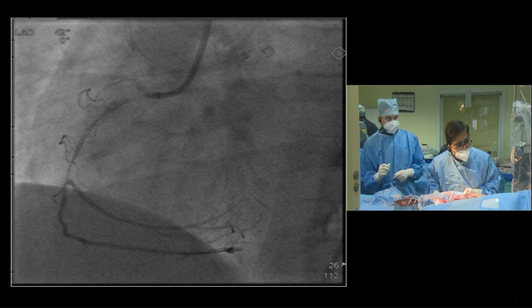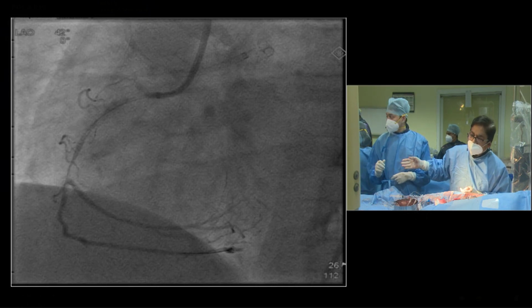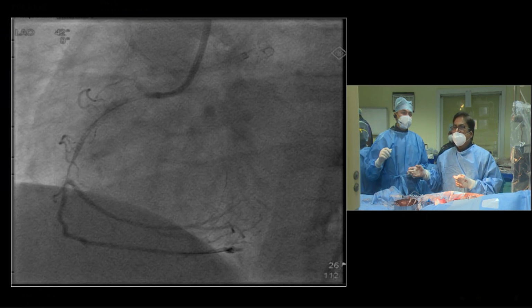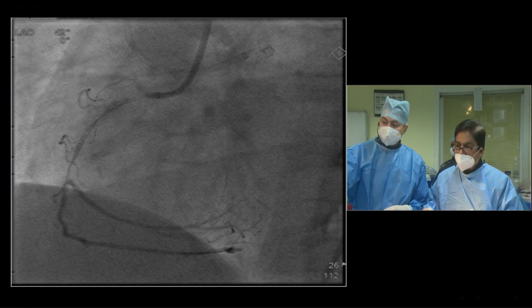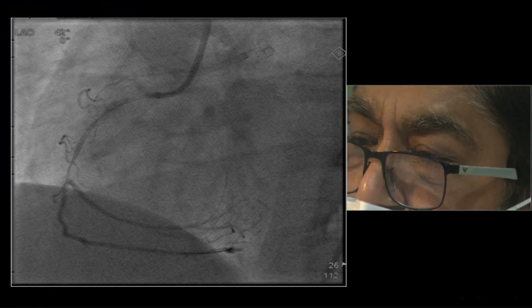One more important thing I just wanted to tell after. Here the bifurcation. The filling of the distal vessel was actually from up to the bifurcation. That is not a good place even for a retrograde wire to enter inside. If it is exactly the bifurcation, the PLV junction is occluded.